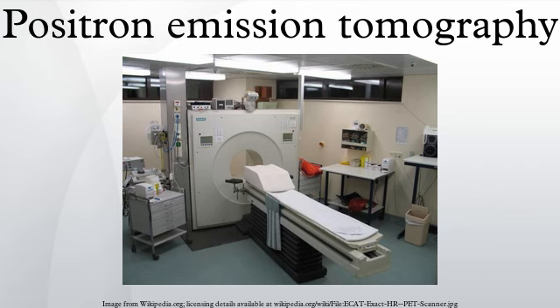In practice, considerable pre-processing of the data is required: correction for random coincidences, estimation and subtraction of scattered photons, detector dead time correction and detector sensitivity correction. Filtered back projection has been frequently used to reconstruct images from the projections. This algorithm has the advantage of being simple while having a low requirement for computing resources. However, shot noise in the raw data is prominent in the reconstructed images, and areas of high tracer uptake tend to form streaks across the image.